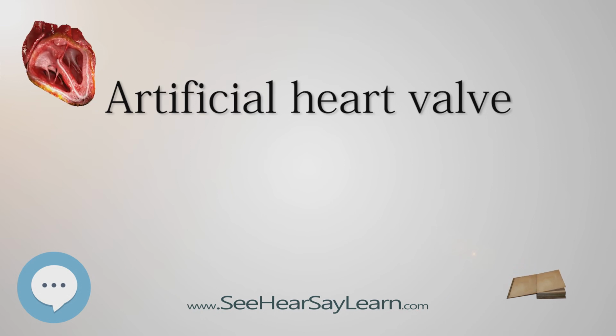Types. There are 3 main types of artificial heart valves: the mechanical, the biological, and the tissue-engineered valves. Mechanical heart valve. Percutaneous implantation. Stent-framed. Not framed. Sternotomy/thoracotomy implantation. Ball and cage. Tilting disc. Bileaflet. Trileaflet. Tissue, biological, heart valves. Allograft/isograft. Xenograft. Tissue-engineered heart valves.